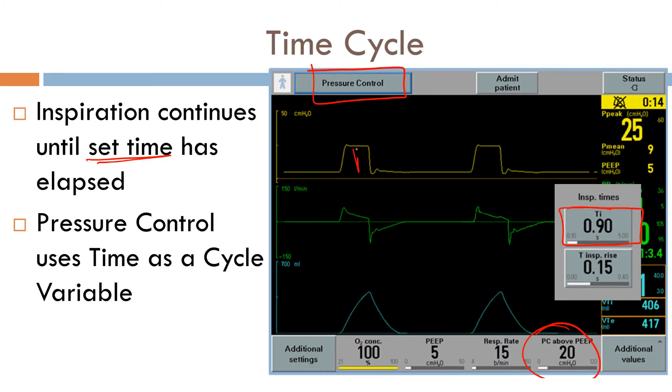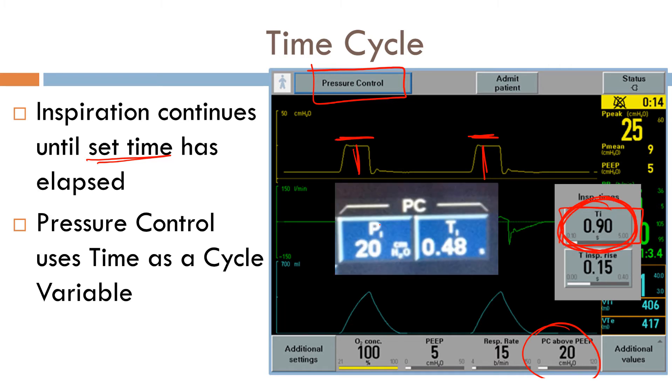So here we can see the amplitude is exactly set. This is our target variable, pressure. It's exactly the same height. However, the duration of each breath is exactly the same. Why? Because each breath is exactly 0.9 seconds. In the Puritan Bennett, here's your target variable. And this has set the duration or the inspiratory time to 0.48 seconds.